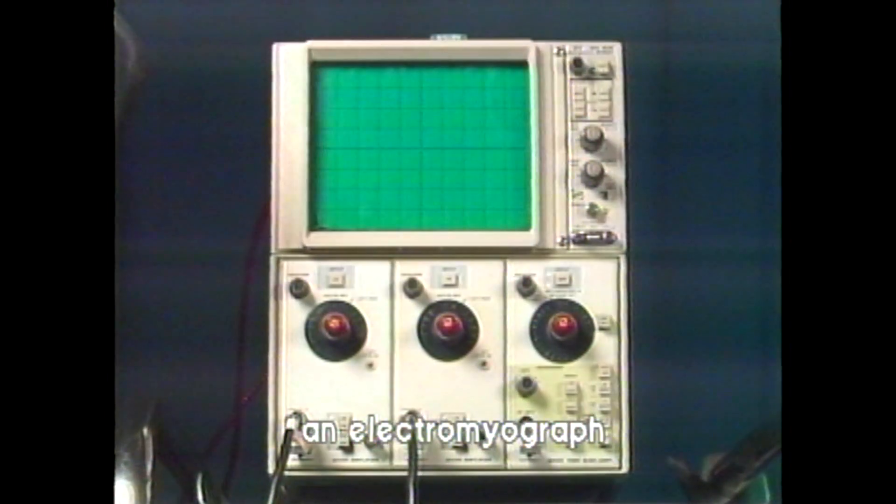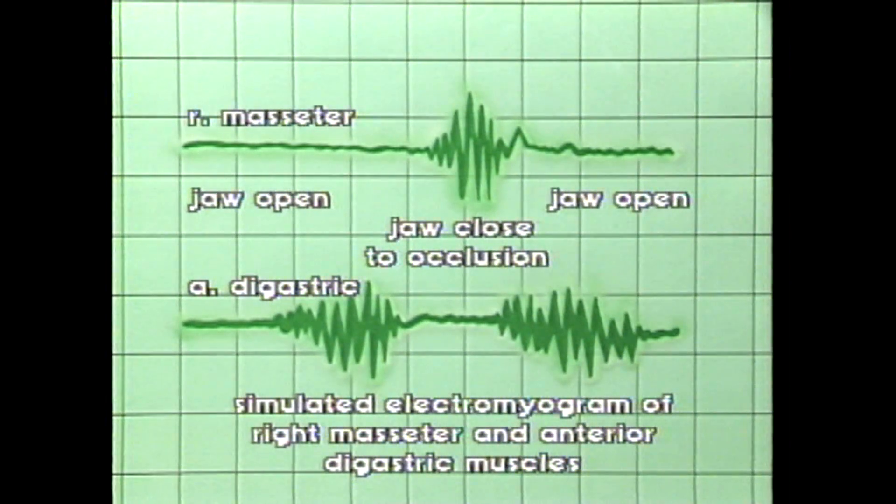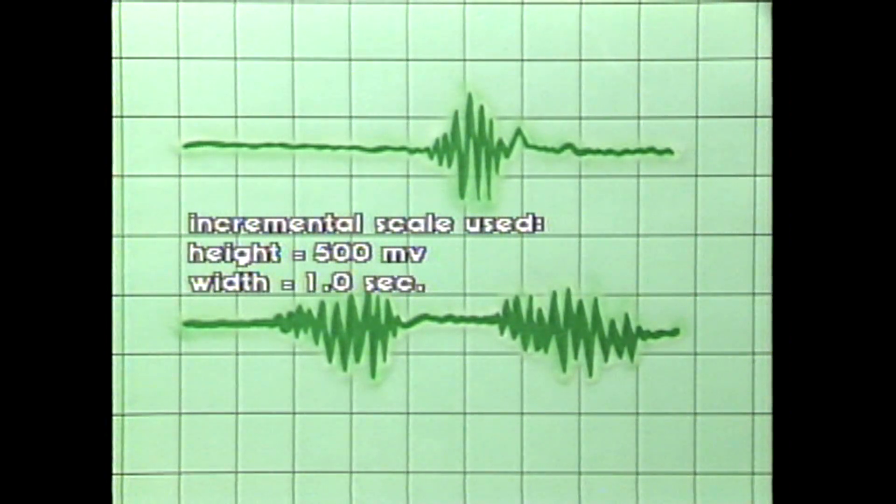The first objective is to demonstrate electromyography. Electromyography, EMG, is a useful technique to quantify information from membrane potentials during motor unit recruitment of masticatory muscles. A recorded electromyogram provides information about the onset, duration, and termination of muscle activity. If two synergistic or antagonistic muscles are recorded at the same time, the relative timing for motor activity for the two muscles can be determined.